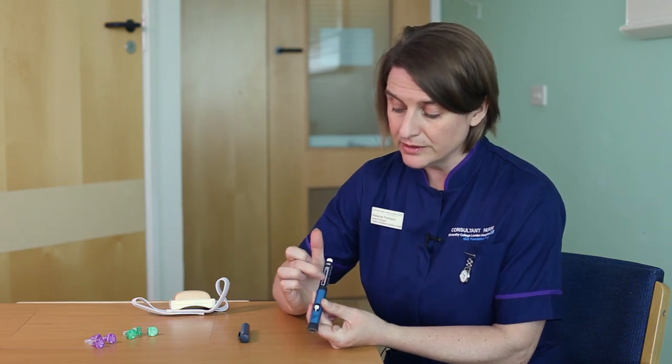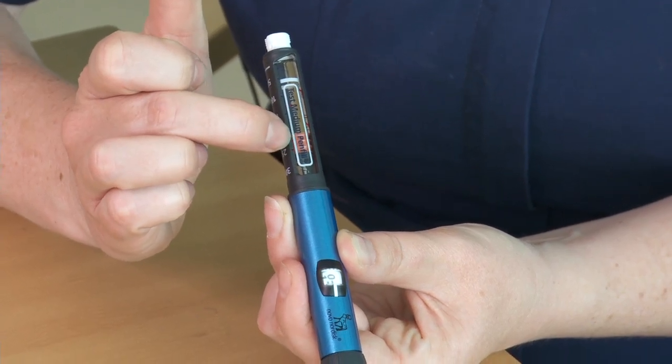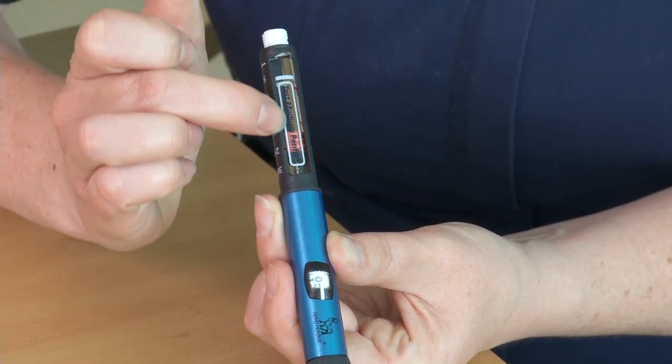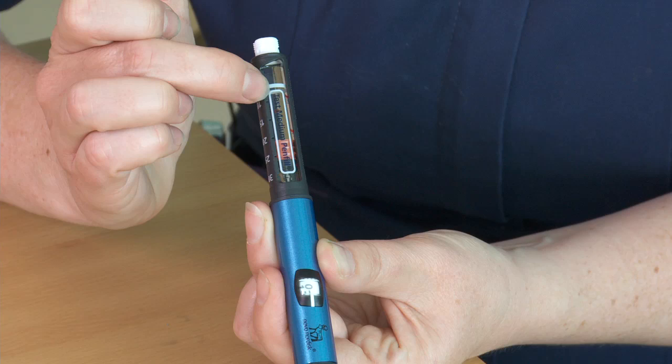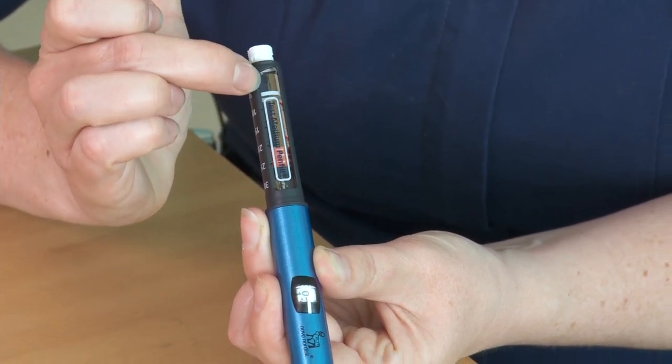If you look in the window you can also see a bung, and that bung gives you an indication as to how much insulin you've got left in the pen. So the bung is here, so I've got this amount of insulin still left to go.